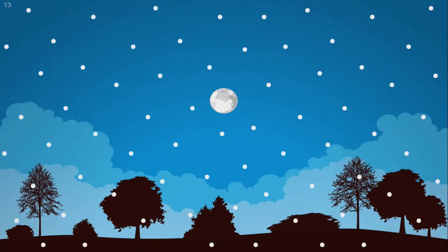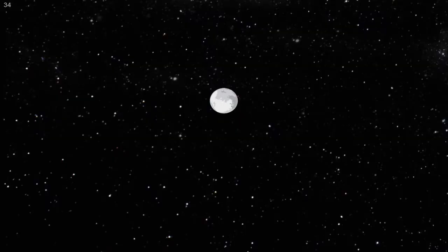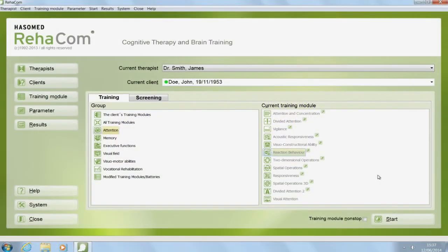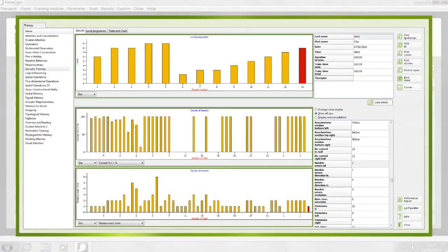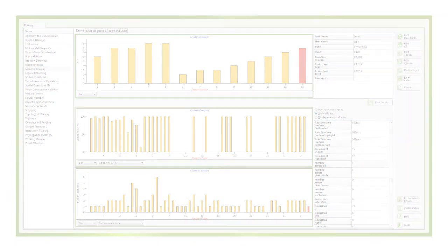RehaCom works auto-adaptively. The difficulty level will rise or fall depending on the patient's performance. With each change in level, the user will receive additional feedback. At the end of a training session, RehaCom will create an evaluation graph. Training results will always be saved automatically, and the patient will continue from this stage when starting the next training session.